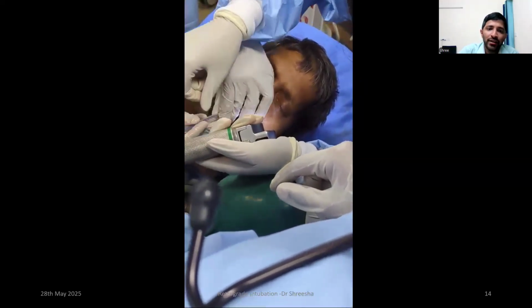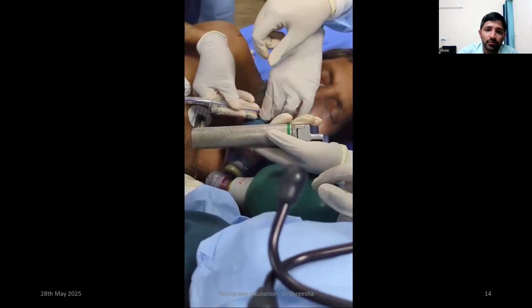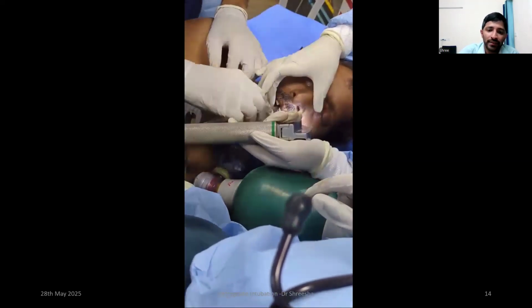And we had to maneuver in order to pass the endotracheal tube, as seen.